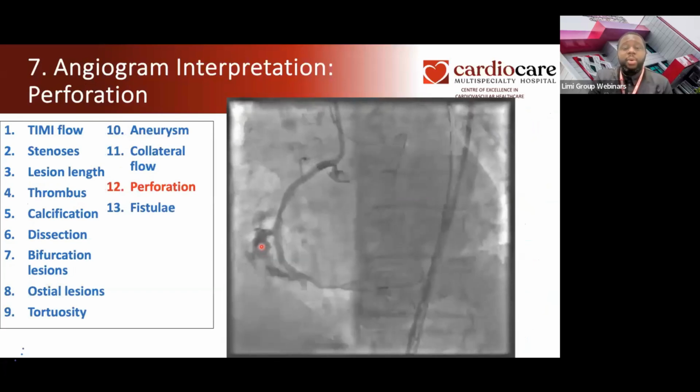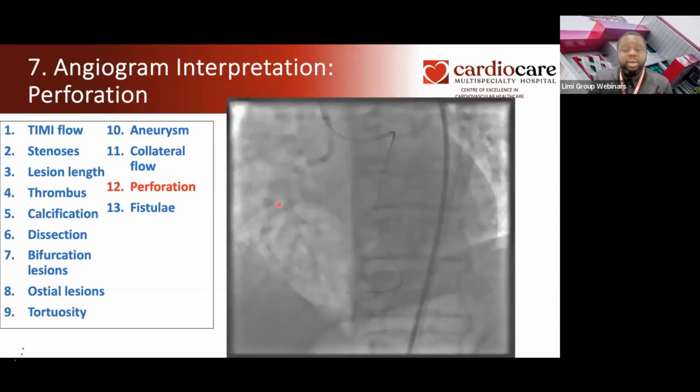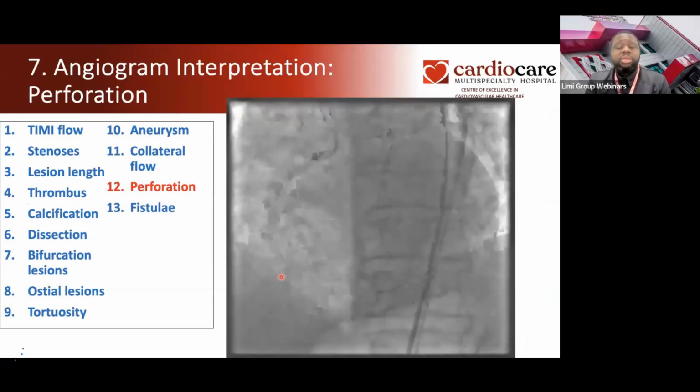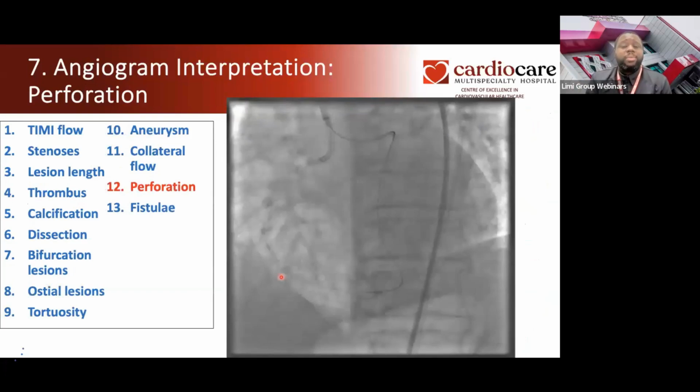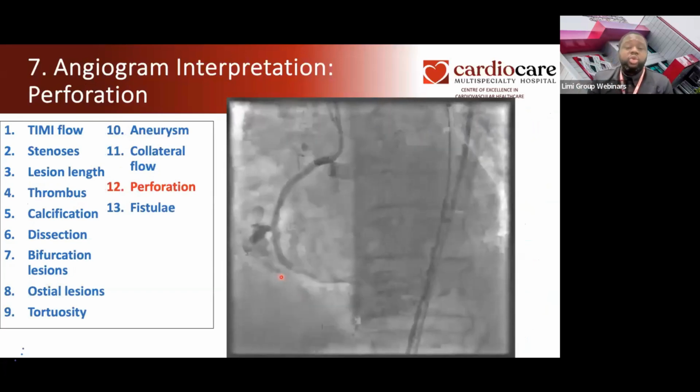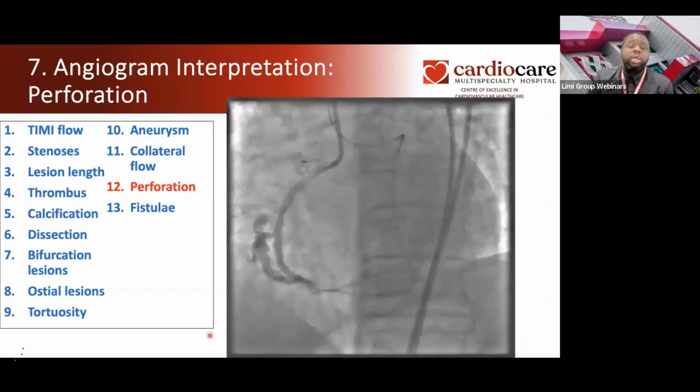This is a complication. You can see there's a stent there. This is gotten from Manobrilakis et al. He published this case. This is a very, very interesting case. According to his reports, they were doing a retrograde CTO. So there was a total occlusion on this side.